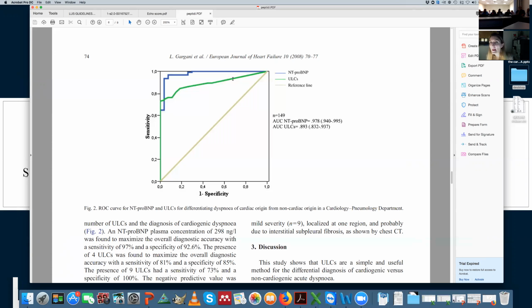But in the single patient, this is exactly the difference between hemodynamic and pulmonary congestion. BNP is a sign of hemodynamic congestion, but you may have very high BNP without extravascular lung water, because your heart is not working well, and you have increased stiffness and increased left ventricular filling pressure. But not necessarily you have the B lines, okay? So what is very useful for the cardiologist, if you have both information, one is more a sign of hemodynamic congestion, the other one is a sign specific of the extravascular lung water.